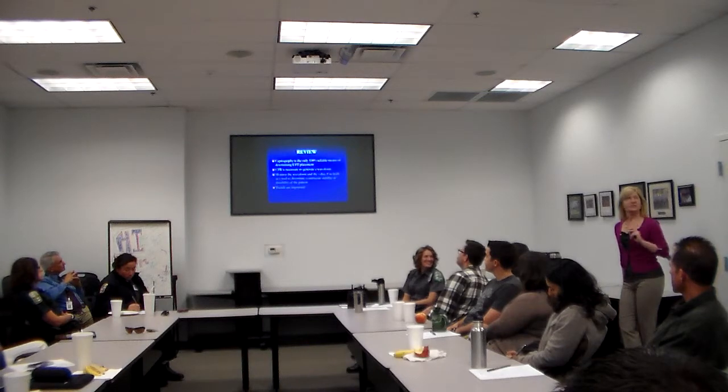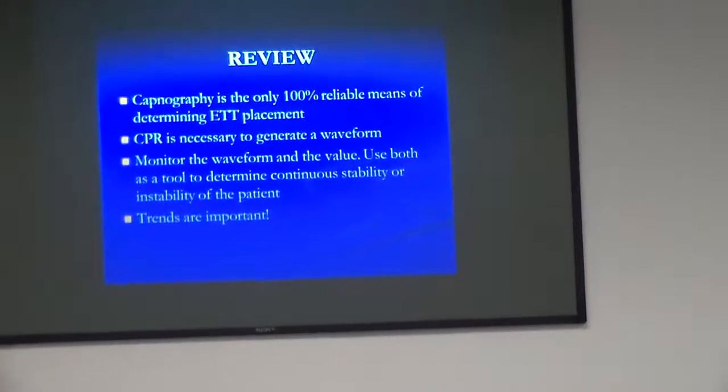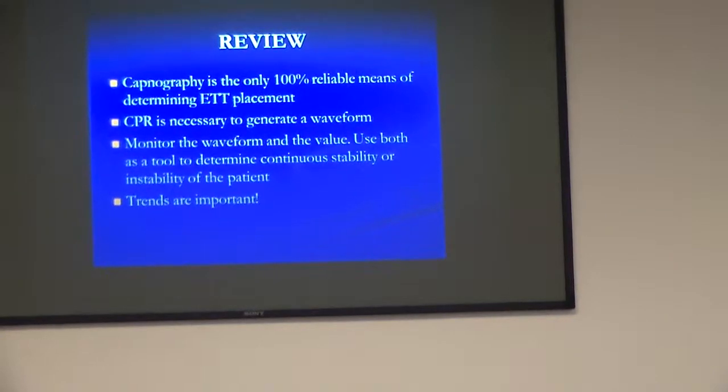So review, since it's Dr. Giorgio's turn to put this all together with different scenarios. It's the only 100% reliable tool for determining ET placement. CPR is necessary to generate a waveform. Monitor the waveform and the value, use both as tools.